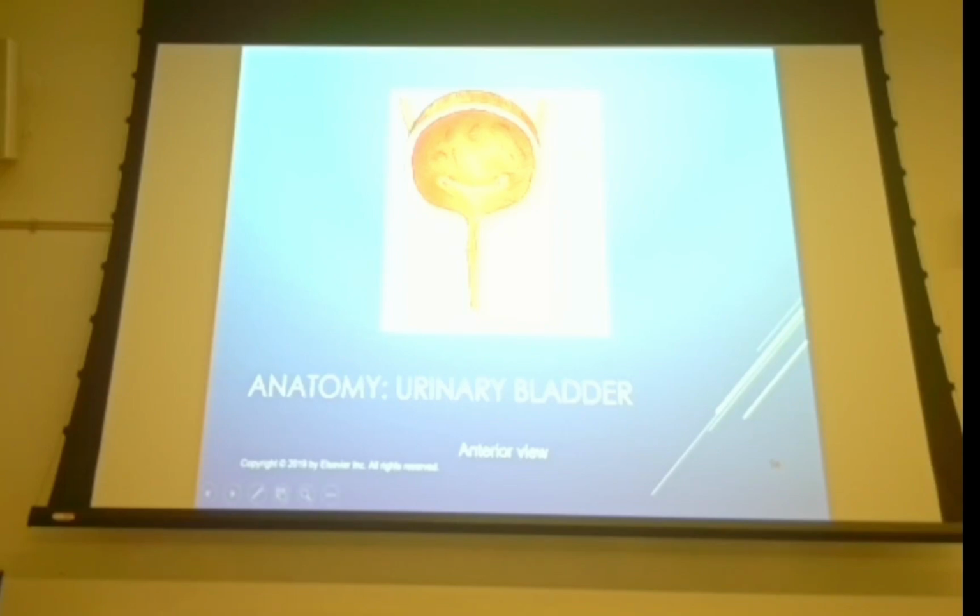But we can also, in the X-ray room, do what we refer to as a voiding cystourethrogram, where we inject contrast just into the bladder, then pull the catheter out of the patient's bladder and watch for reflux up the ureters. We'll talk more about that here in a bit. There's a specific demographic that sees those exams, so we'll talk about that in a bit.